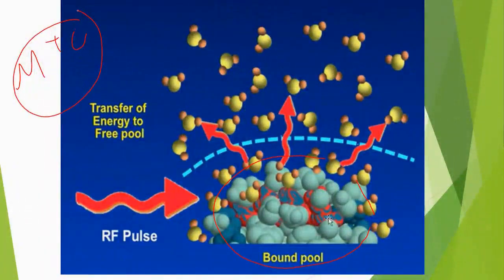It suppresses the signal from the tissue, allowing you to have the remaining signal, like from blood. Blood, especially cerebral blood, doesn't stop moving, even if it receives the saturation I already mentioned. The RBCs that have been affected continue to move on, new blood comes in, and if I apply a short sequence, I can receive a signal from it.